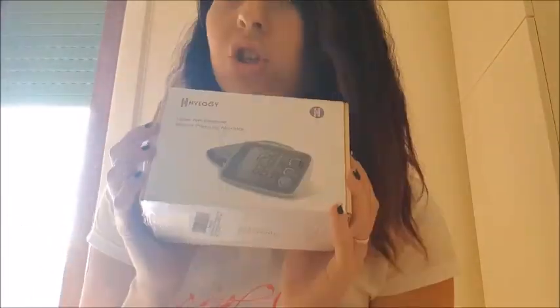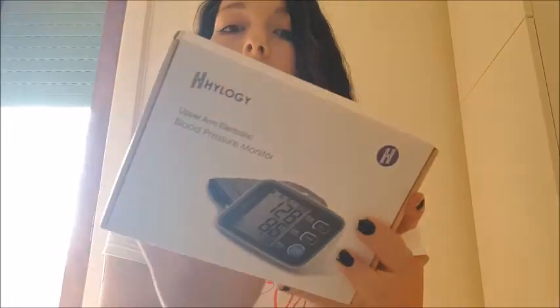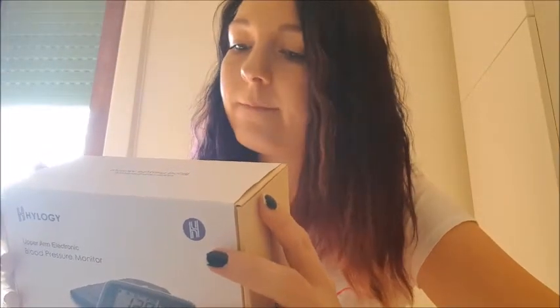Now moving on to the second item — the blood pressure monitor. Using my nails to get the plastic off. The box is nice. It's easy to use — it just has three steps: preparation, measuring, and memory check. And it has memory for two people.